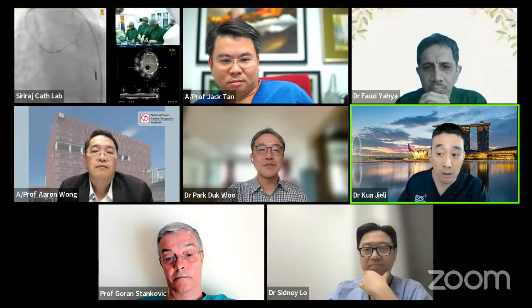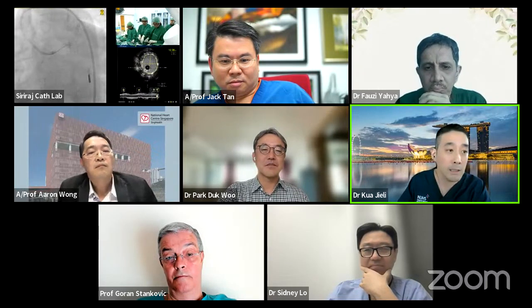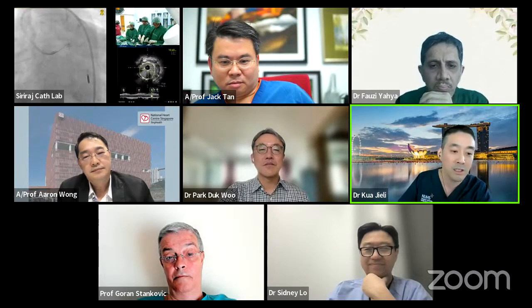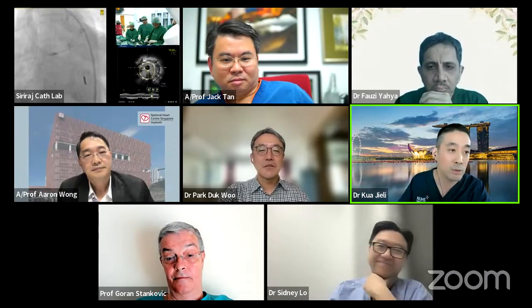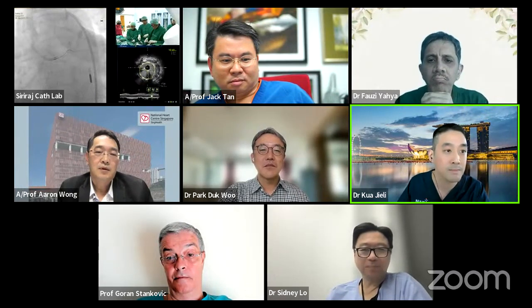I do also agree with Aaron that there are a lot of factors that may limit use of imaging: time, money. Sometimes you have 5 cases outside the lab, and when you say I want to do IVUS, the cath lab staff looks at their watch, and you know that it's a job that you have to get done quickly. So I do agree that there are limitations, but yes, if there is a chance where I can do it, then I will definitely try to do it in my cases.